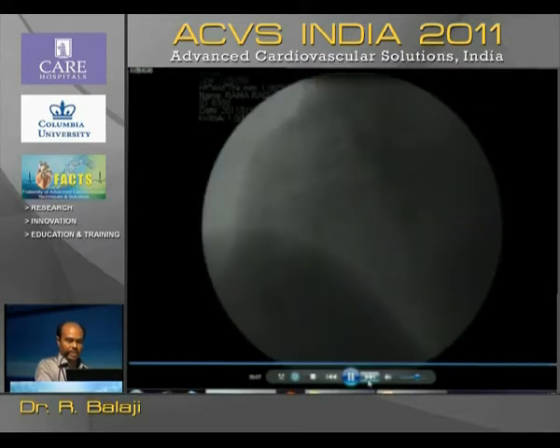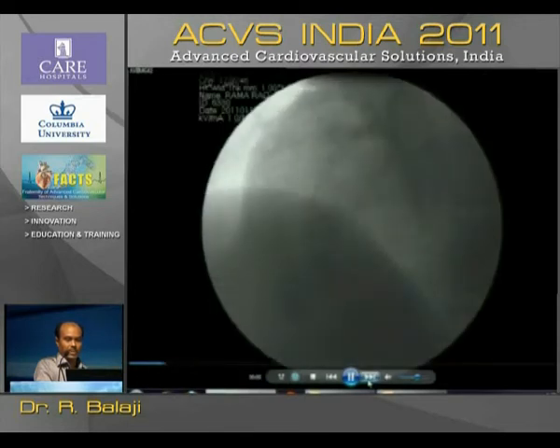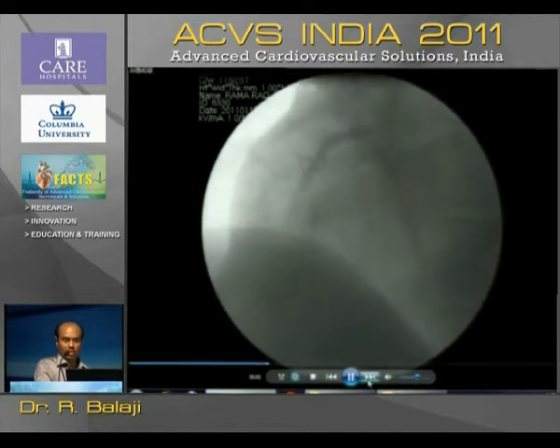So after some nudging and prayers, it just went, and then we positioned it appropriately against the perforation and started inflating. When it started inflating, it was not inflating properly initially, and then it inflated, and then we removed it and took one injection. The injection showed no reflow or no flow. After some amount of nitroglycerin, soon the flow got cleared.